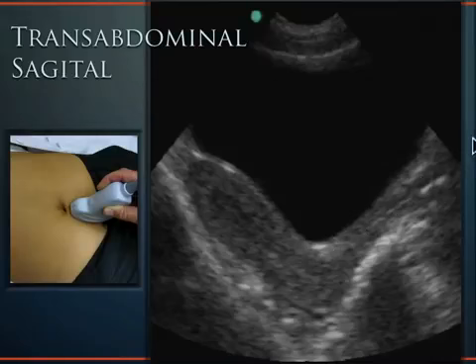Now, if I took the intracavitary probe, or the endovaginal transducer, and I insert it into the vaginal vault, I would eventually come to the cervix, and when I land on the cervix, that's when I stop inserting the probe. The sound comes out over this whole area right here, and I get really high-res pictures of the uterus and the pelvic contents, because I've got that high-frequency transducer. So I'm just kind of throwing this all out there for anatomy and stuff.